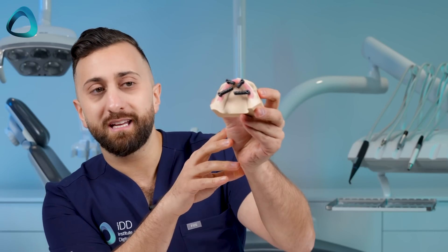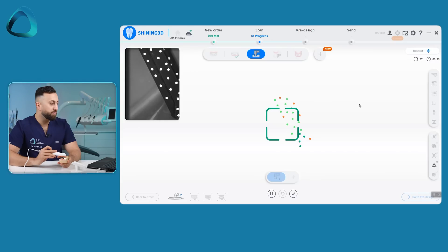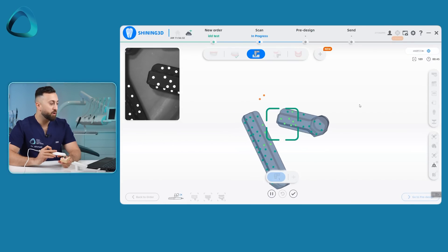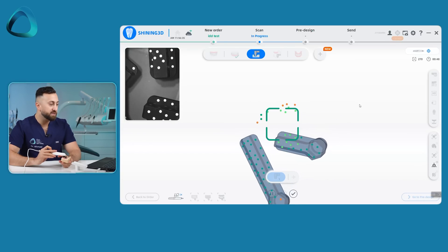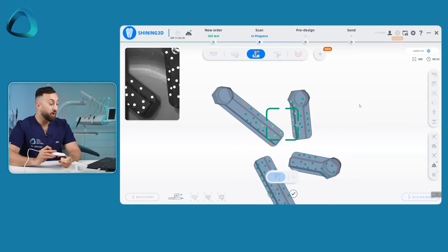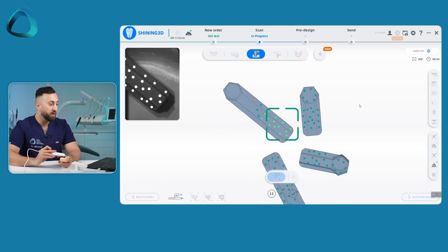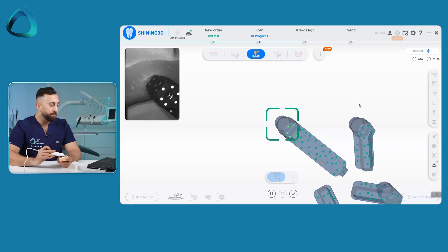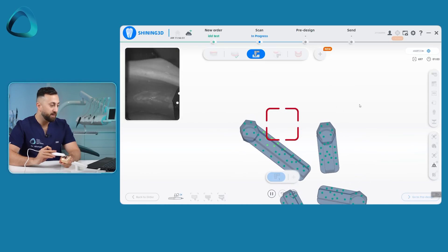Just like that, this is the full arch with these special scan bodies in place. On the software, this is really where the magic happens. The next step is not to scan these like traditional scan bodies — what you actually do is scan the dots. The software is totally ignoring the scan body; it's just seeing the dots. Once it recognizes the dots enough, it aligns the digital file of the specific scan body onto the arch. The company says you want all the dots to be green — some will start orange — and once they're all green, you are done.